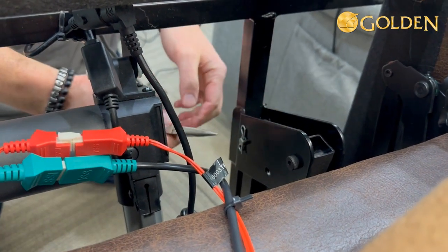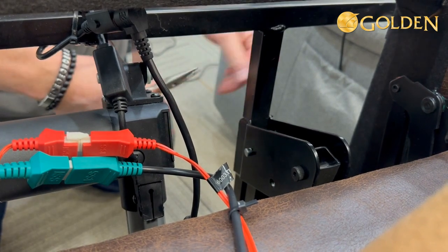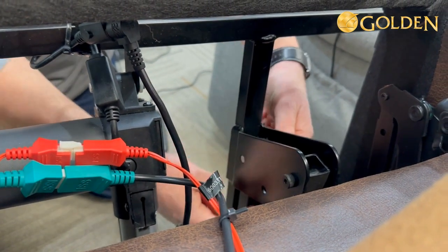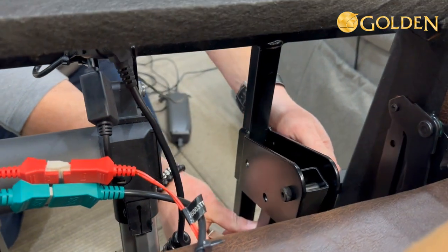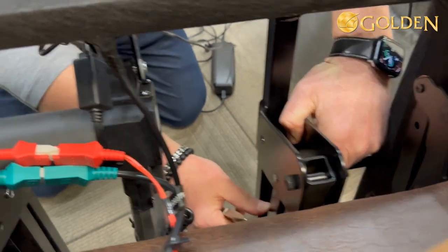To do that, you take this spring out - using needle nose pliers makes it a little bit easier. You just want to pop this pin out, then you're going to move this bar from the bottom location to the top location, and put the pin back in like so.